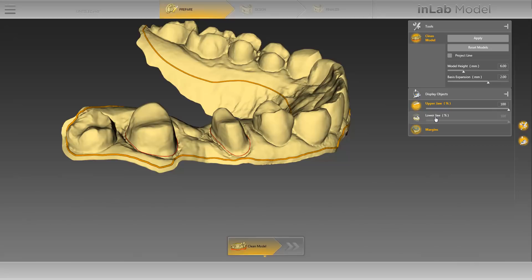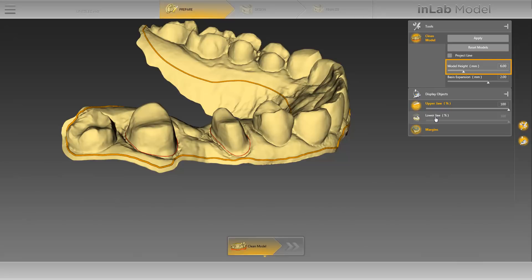When cleaning the model, make sure that you leave sufficient distance to the cut line, particularly in the area around the preparations for creating model stumps in the next step. In our case, the line is located close to the preparations as the intraoral scan has not been carried on over to the vestibular side. A smaller distance between the line and preparations is not recommended. By clicking on Reset Models, you can reset the newly defined cut line. By activating the Project Line option, the changes made on one of the jaws will be directly transferred to the opposite jaw. Using the Model Height slide controller, you can adjust the height of the model base. Please note that insufficient height may result in unstable support of the stumps. We will leave the height at 6 mm. You can also define the width of the model base. We will calculate our model using an expansion of 2 mm.